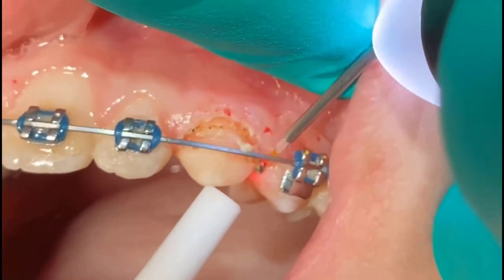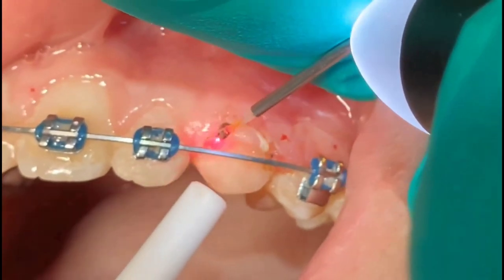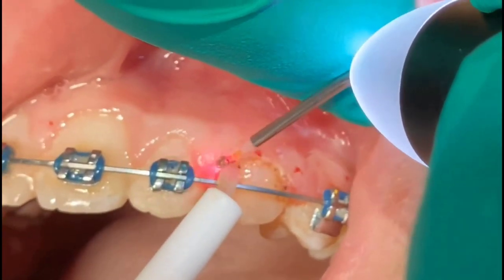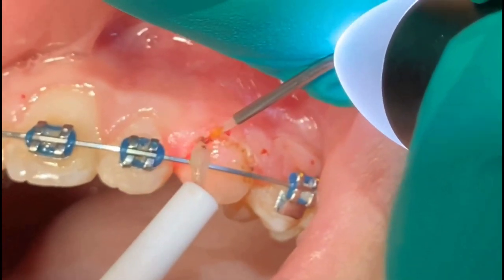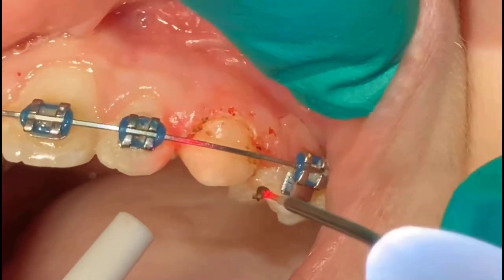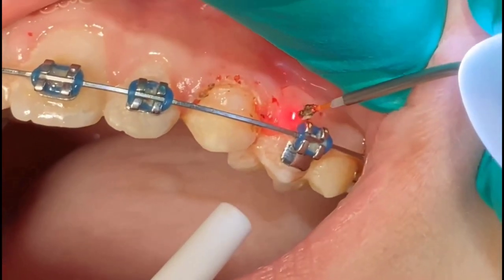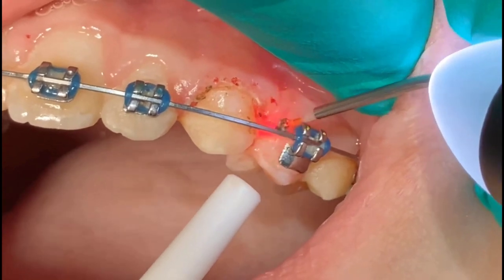We're dancing around under the wire. Very quickly, you're going to see this piece disappear, just like that. Now you see the tissue. Now you see how, look at that. Not absorbed by the tooth. Look how clean that is. The tissue's totally exposed. The tissue is going to heal right now. Do a little bit more here by the bicuspid, just to give a little bit of access.